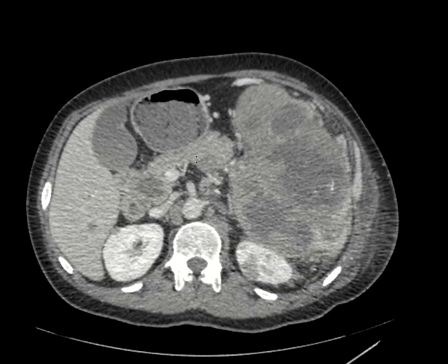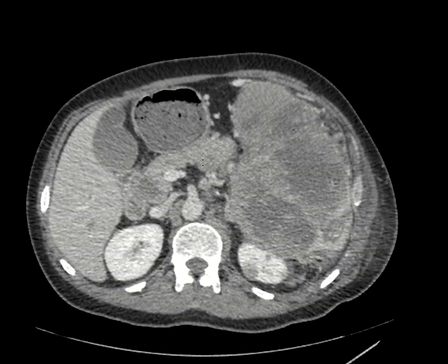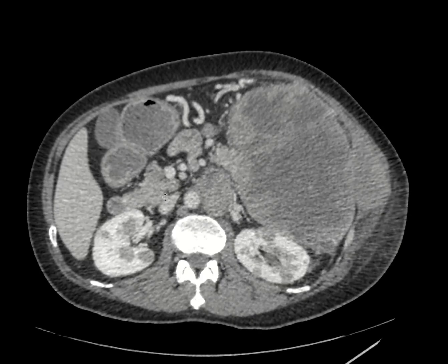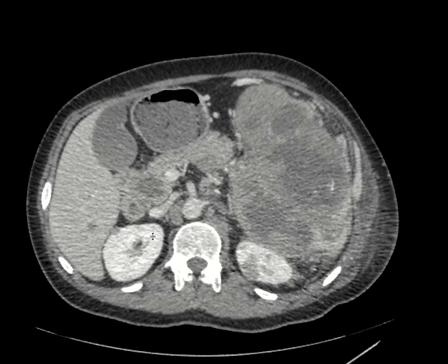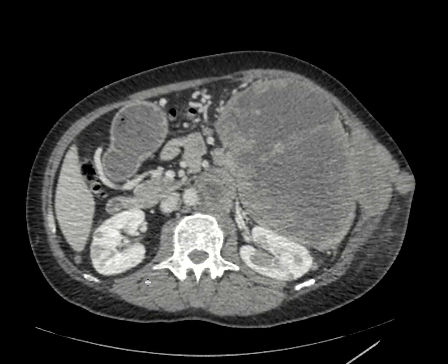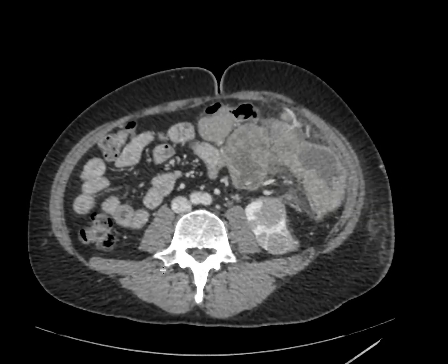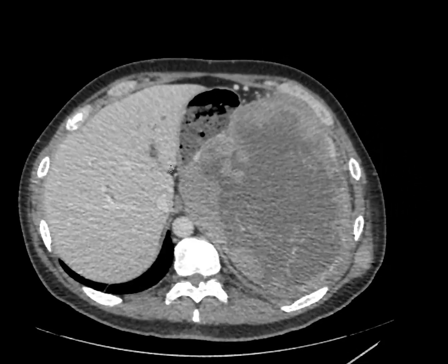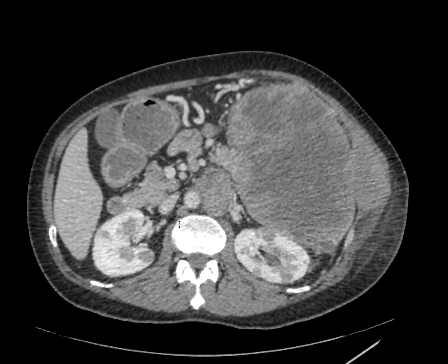We can see here's the pancreas, and we can see that there's a mass involving the pancreas. There's another mass here involving the pancreatic head, and we can see other smaller masses involving the pancreas. And then we have a number of renal lesions here as well that don't appear to represent simple appearing cysts. And in the setting of all of these masses, they are concerning for metastatic involvement.